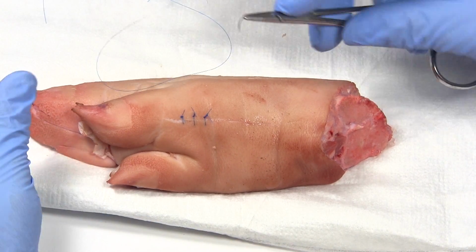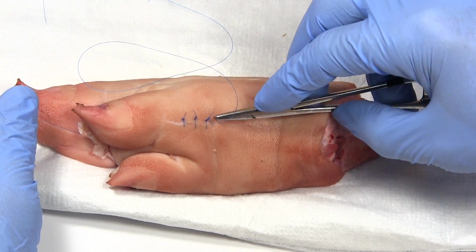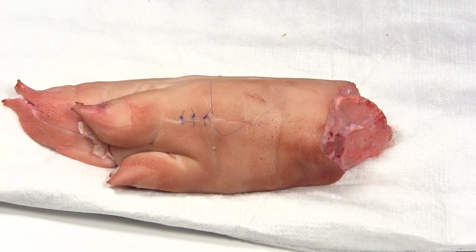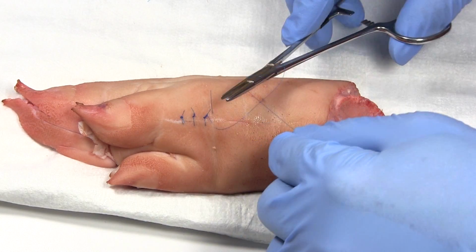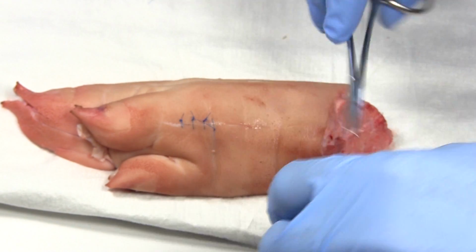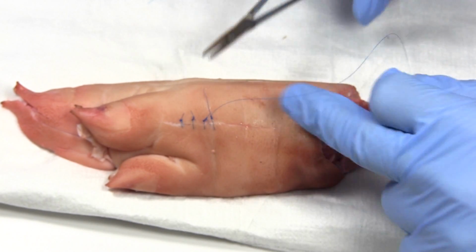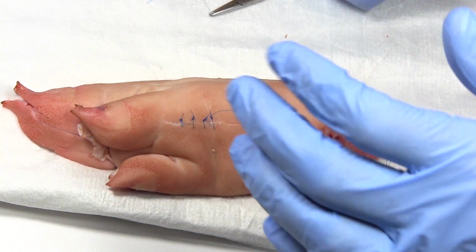So the technique is very much the same. You start out exactly the same. Put in a regular simple interrupted suture. Exact same technique. Pull that through most of the way. And then you tie a knot just like you would for the simple interrupted. Two throws. And then several single throws. Take that knot, pull it over to one side, and you trim off only that loose end there. You want to leave the other end attached.